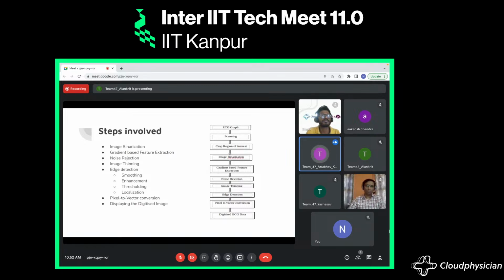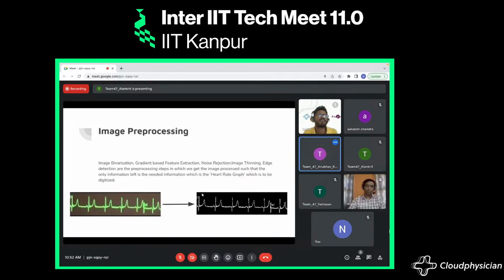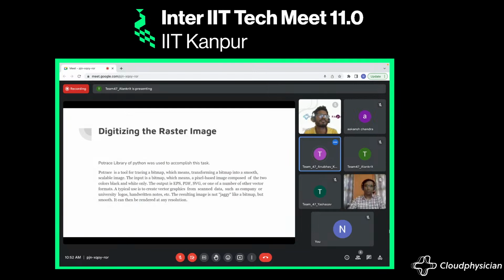We are scanning it, and we have been given the cropped image, that's the region of interest. First we binarized the image. This is proper image processing, where we are just thresholding the image, so we can convert this image into this image, which is the only information that we need for heart rate digitization.